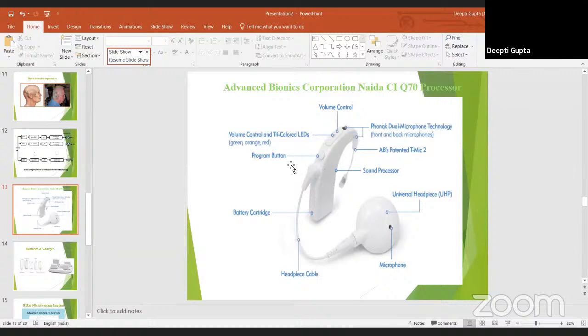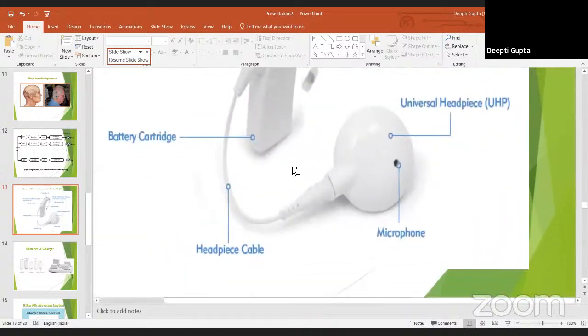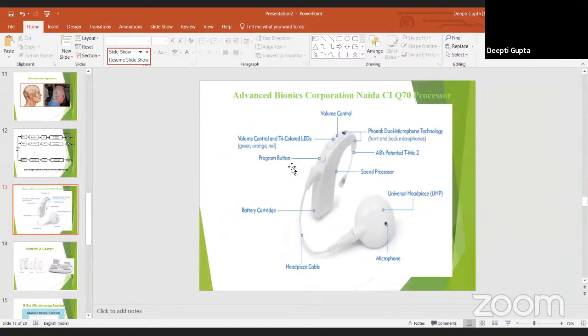And if it blinks 5 times, it means a response to AB My Pilot, a request to find a paired device. What is AB My Pilot? I'll explain it a little bit later. So it is for that purpose. And now come to the green.